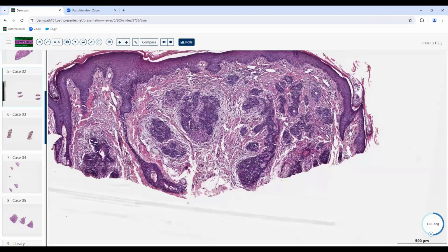So in the same realm, a trichoblastoma would potentially be a deeper lesion, usually far more cellular. I thought it'd be a little bit unfair to include that. Maybe a MAC, perhaps, which would be more infiltrating. Almost too easy, but they might put that in there.